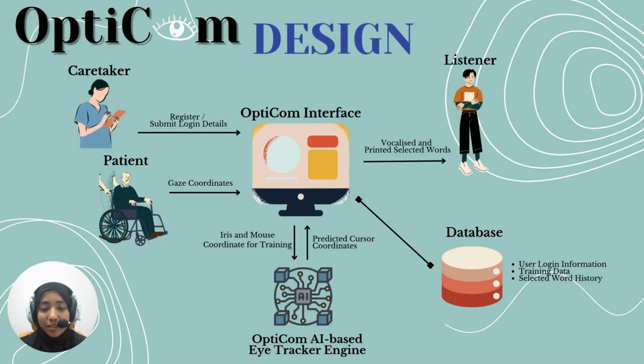Let us take a look at the system design framework. Firstly, before using the system, the caretaker must register and log in for the patient, since at this point the eye tracking algorithm is not yet running. Once logged in, the patient will go through a calibration phase where the system collects iris coordinates from the user and cursor coordinates from the user interface itself.